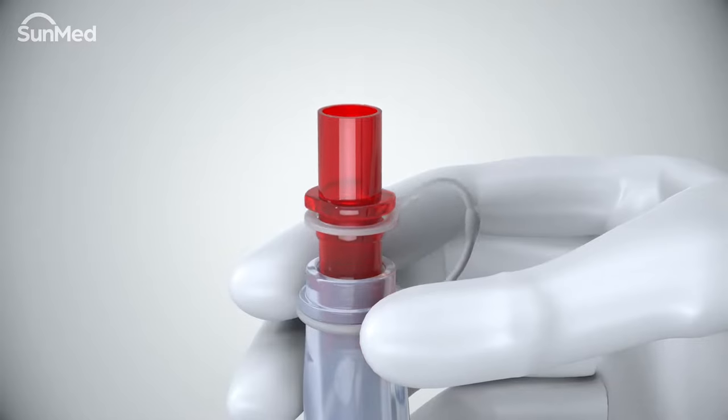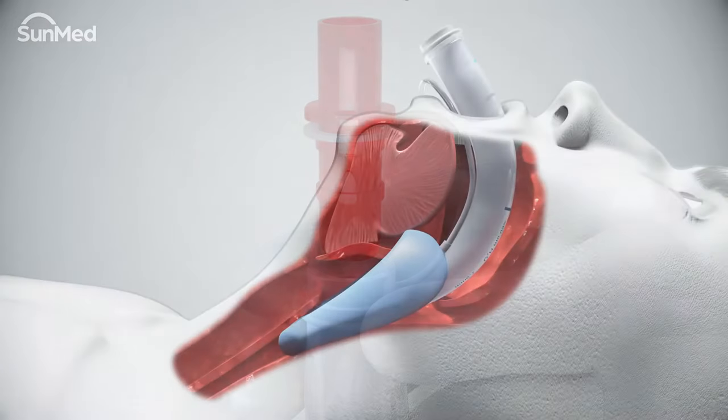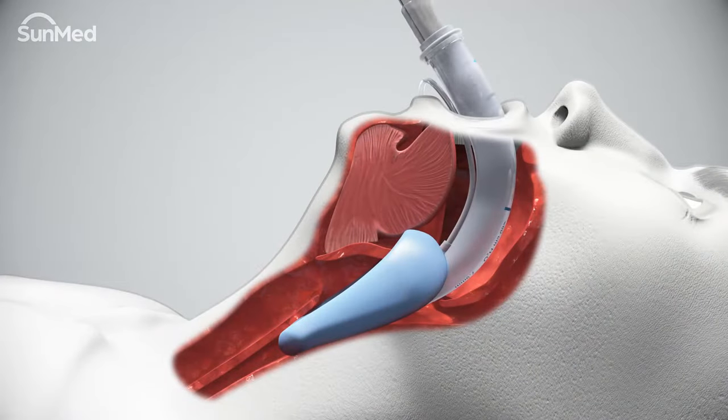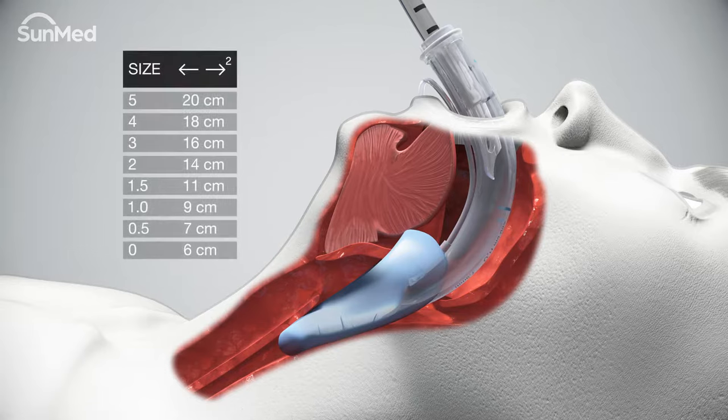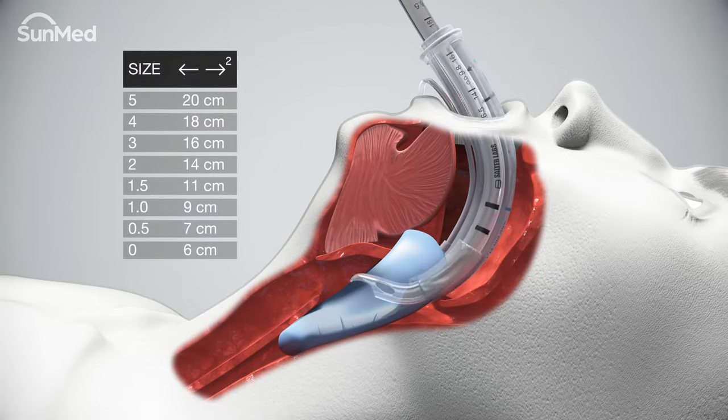Pass the lubricated endotracheal tube into the airway tube and distribute the lubricant within the shaft by moving the endotracheal tube up and down until it travels freely through the entire airway tube. Insert the endotracheal tube to the appropriate depth depending on the air Q3 size.